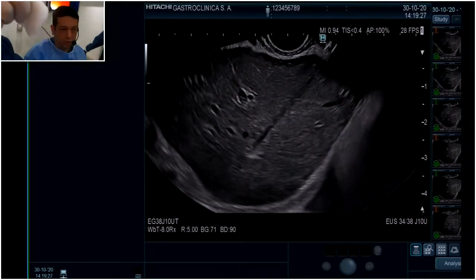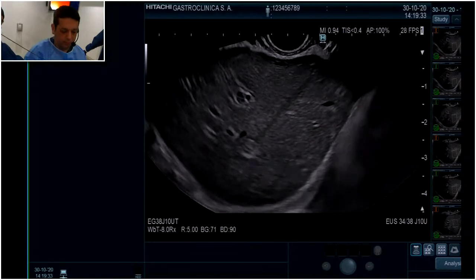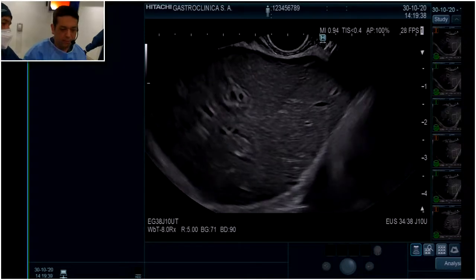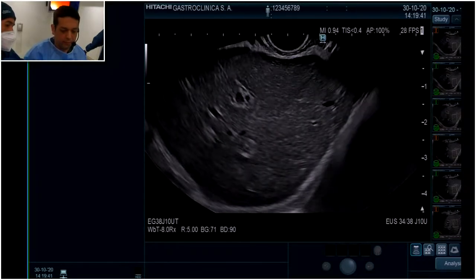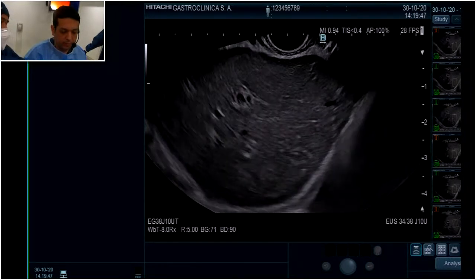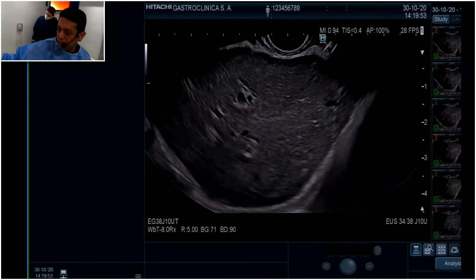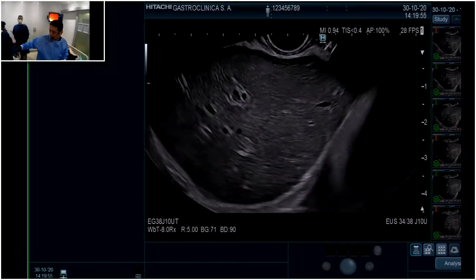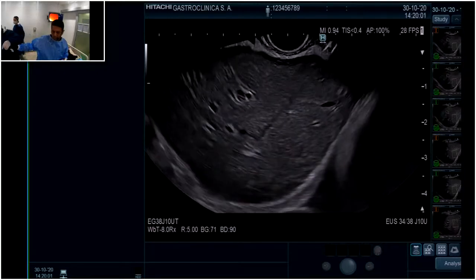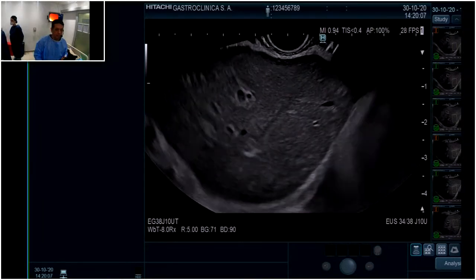So now, you see, I am just taking off the needle. My plastic part is inside. Sí sale. Perfecto. You can show. Déjame mostrar. So, you can show it. You see? So now we retire just the estilet, the needle, and we continue with the plastic part inside. I see my plastic part here.